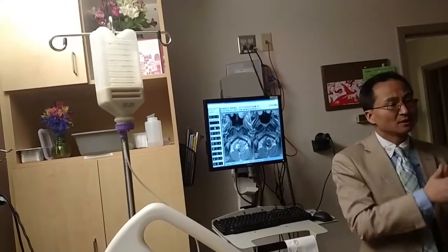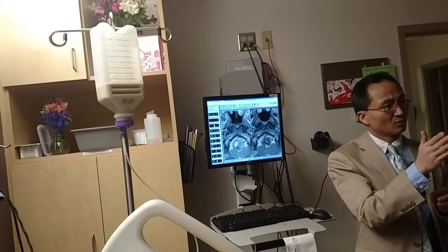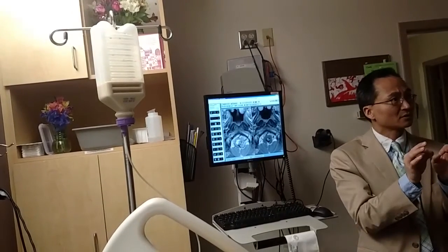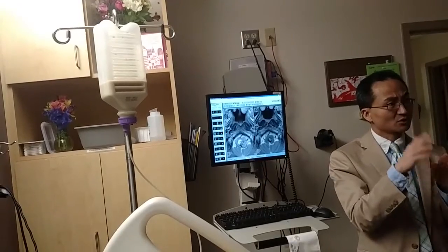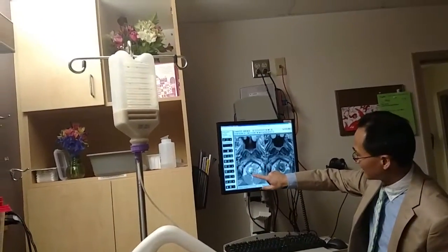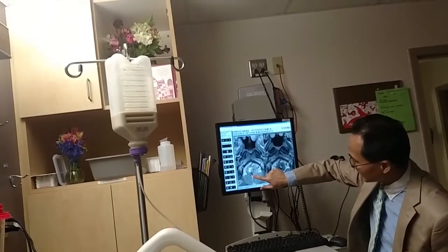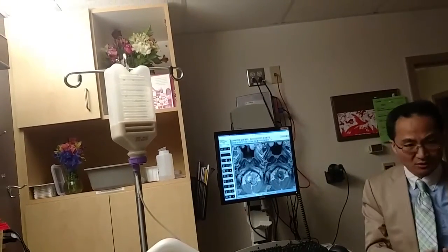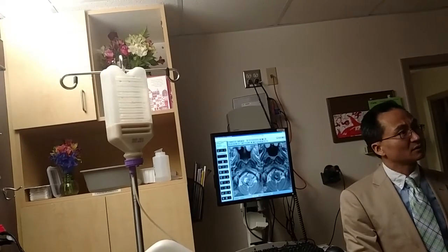It's not sharp. But when you do your dissection, no matter how gentle you are, it is an instrument. You can spread and do all kinds of things, but nonetheless, it's not like the liquid itself. So the liquid has presented itself more to the surface in this area, so we can go right here, and there will hopefully be a layer of blood clots that's now liquefied, and that's what we're waiting for.